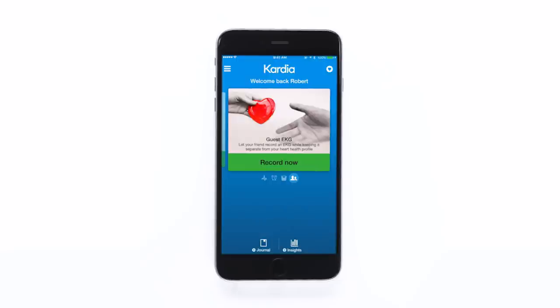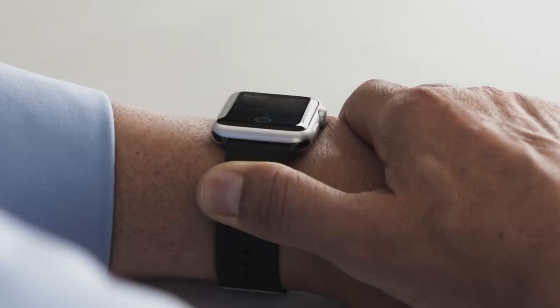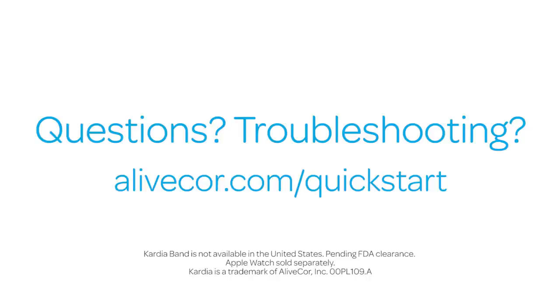A few points to remember: Don't use Cardio Band while charging your watch. Don't take a recording while driving or during physical activity. And to get the most accurate reading, keep your watch, forearm, and hands still during the recording. Questions? Troubleshooting? See our user manual.